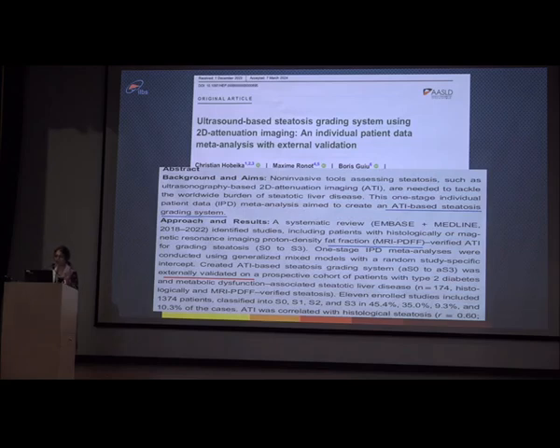So there are 2 papers only which I'm going to mention. There are not many studies, but there have been a few studies in the last 5 to 6 years, mostly from the Southeast Asian countries and Japan, which is where this equipment was manufactured. Most importantly, Canon came up with this technology first, and they have a patent on that.